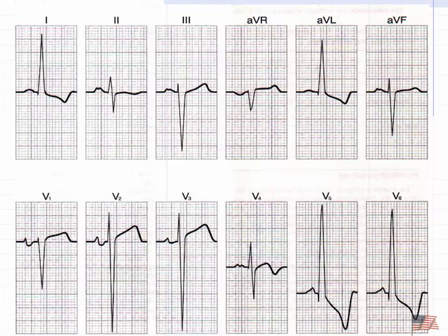Knowing all that, here's a 12-lead EKG, a sampling of the various tracings in each of the leads. Where is my axis deviation, or is there any axis deviation? AVF. Oh, AVF is down. Okay, so which is it? If I have a positive in lead 1, meaning it's going right to left, but AVF is negative, meaning it's going from the bottom to the top.